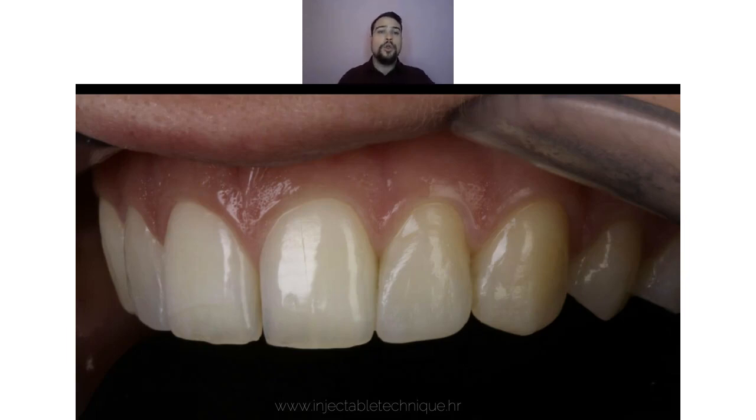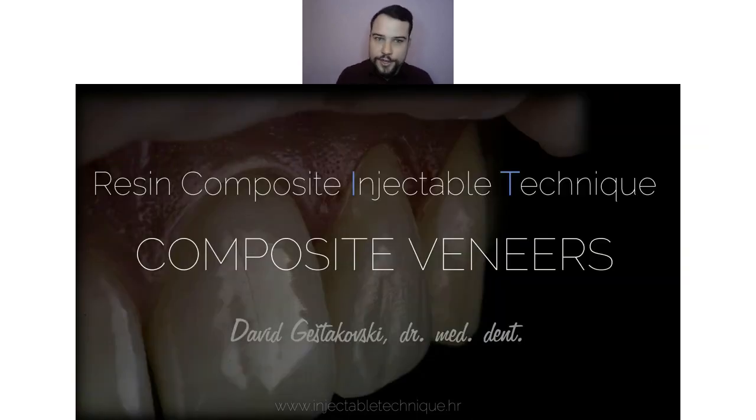And trust me, all of you who are watching this, if you had the same patient and if you had the same transparent silicone I used for this case, you would get the same aesthetical result. I hope I caught your interest.